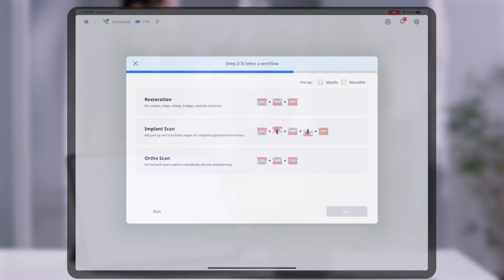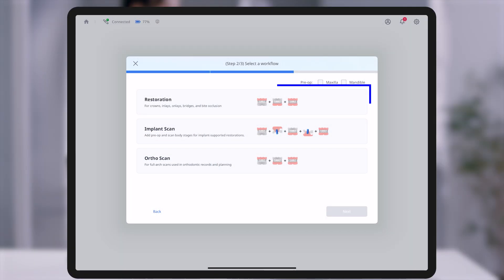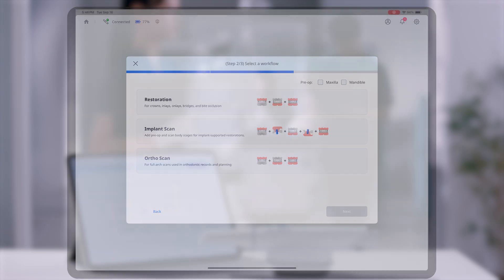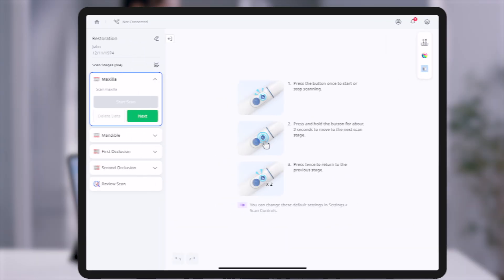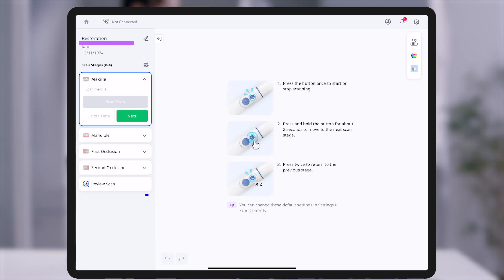Treatment scan mode offers three workflow options based on clinical purpose. Restoration includes maxilla, mandible, and occlusion, ideal for general prosthetic work.